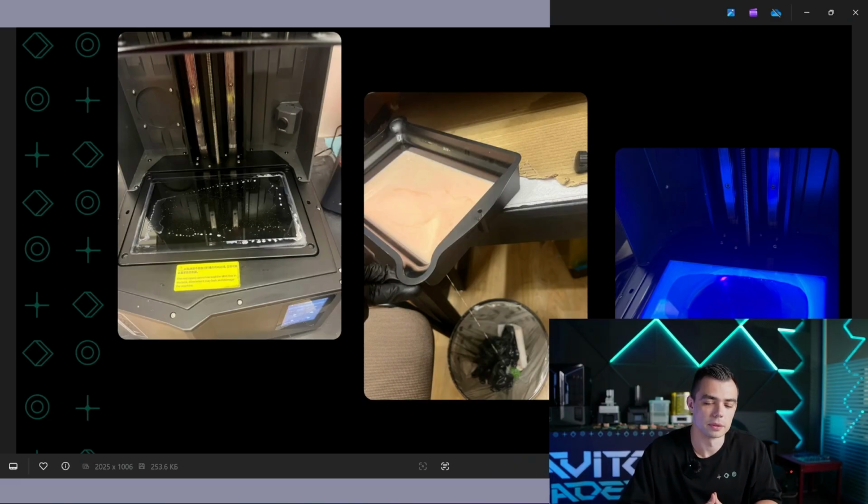And the last but not least recommendation: please, everything should be done in advance. When we have a date of surgery, for example the 20th of July, we make the surgical guide by the 18th of July, just an example. So we leave at least one day before surgery, just because some problems may occur the day before the surgery. And you see right now an example of such a thing.